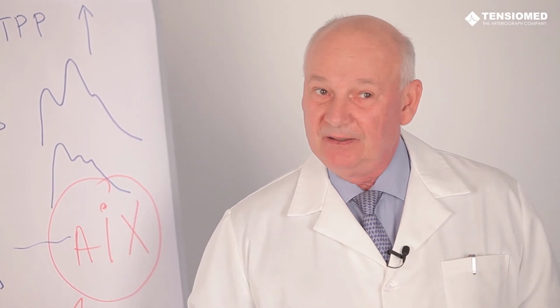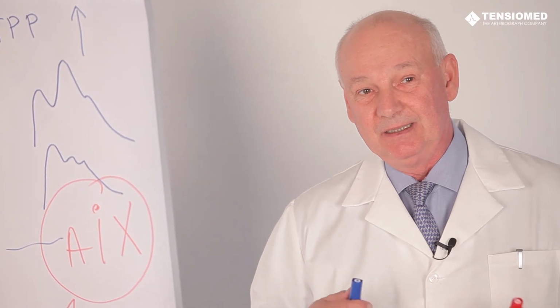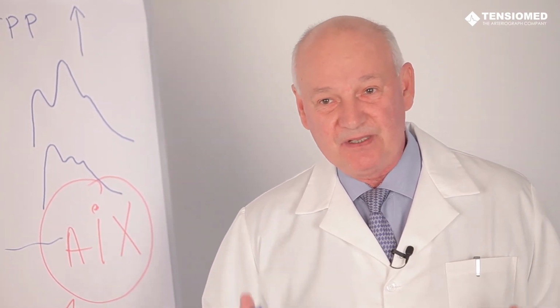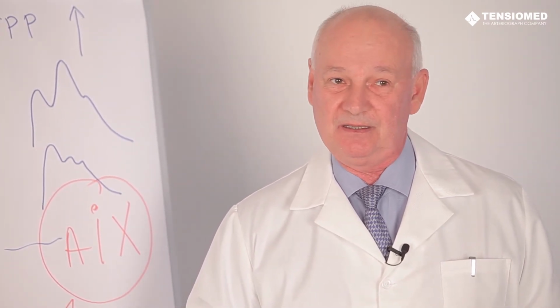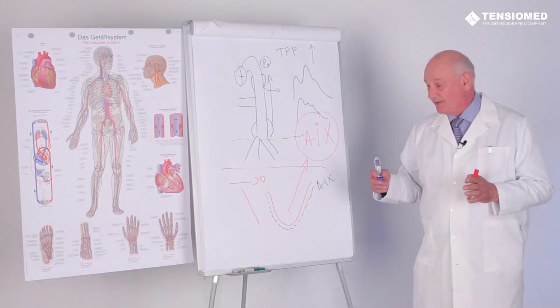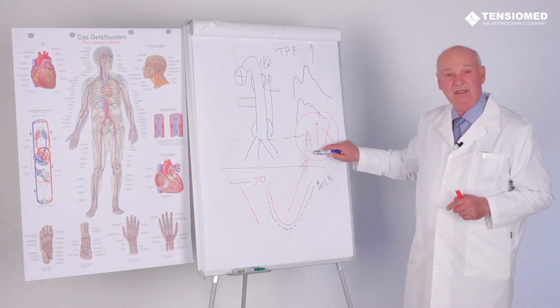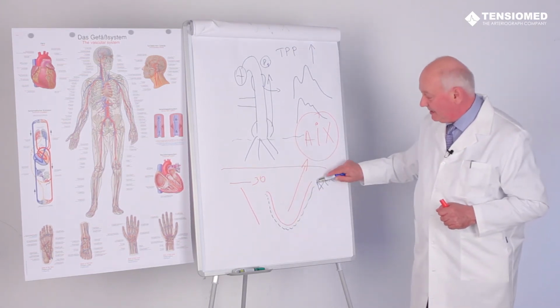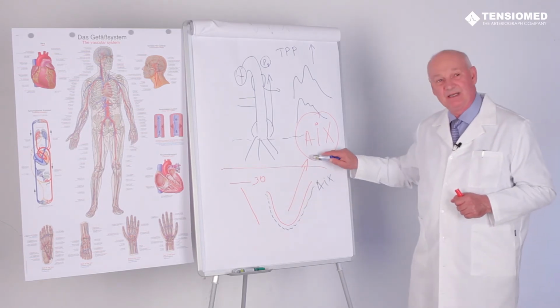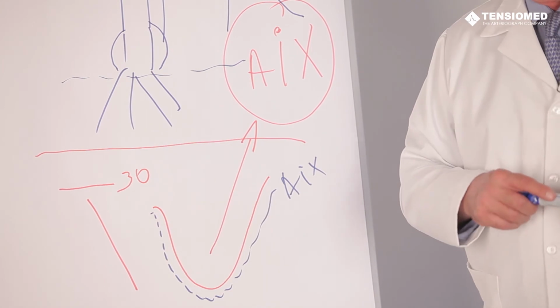Endothelial dysfunction, which involves diminished physiological nitric oxide synthesis, goes together with increased peripheral vascular resistance. Consequently, measuring the augmentation index and the peripheral vascular resistance is related to the development of endothelial dysfunction.